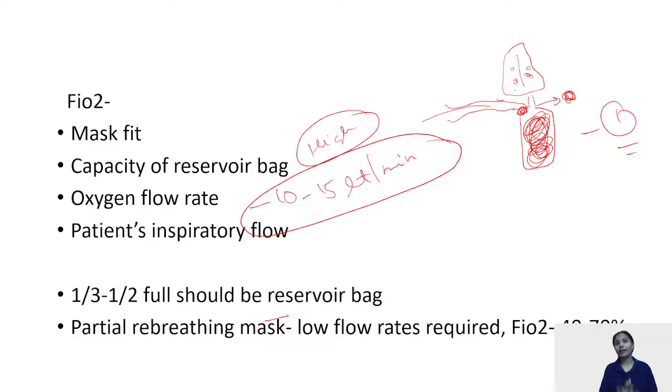After that, after exhalation, there is one more thing I want to emphasize here. I hope you all remember that extra H. Yeah, that's your expiratory pause. A expiratory pause comes in our breathing pattern, which is around 0.5 seconds. And when this pause comes, there is no exchange which is taking place. This is at this time that pure oxygen is entering the reservoir and filling it and getting the reservoir ready for the next inspiration.